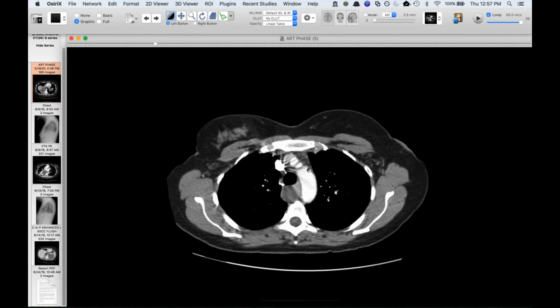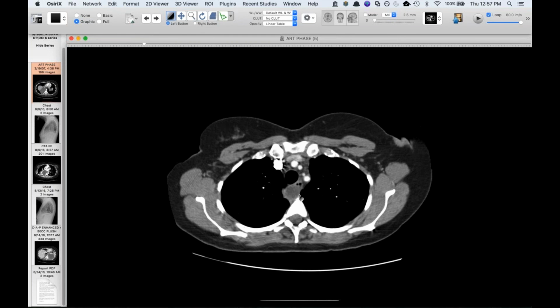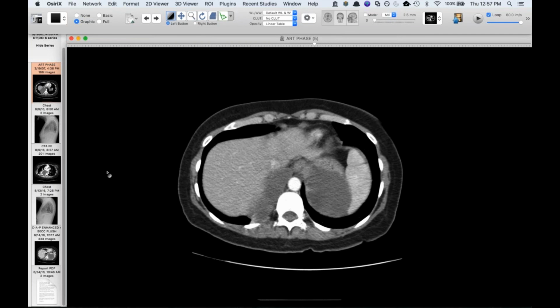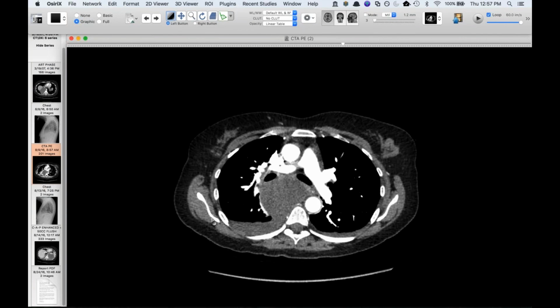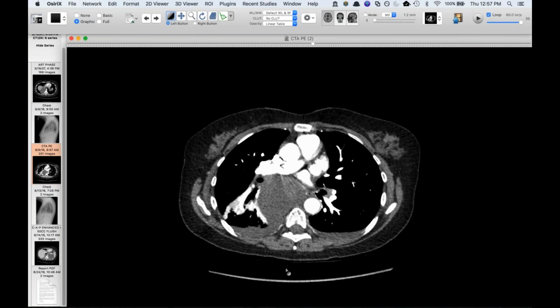And so at the time, this was thought to just be, there's a peculiar little dot of air right here. But they thought this was just a massive foregut duplication cyst. I don't know. I don't think I've ever seen one this large traversing the diaphragm, but she comes back. So this was the time of that other radiograph when it was still all fluid-filled. And it's gotten larger, and she came in at this time with chest pain.